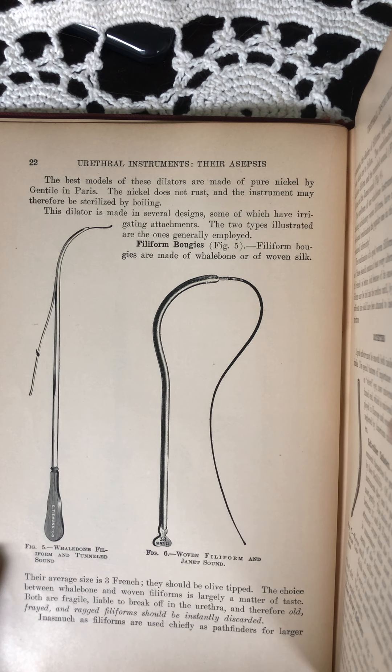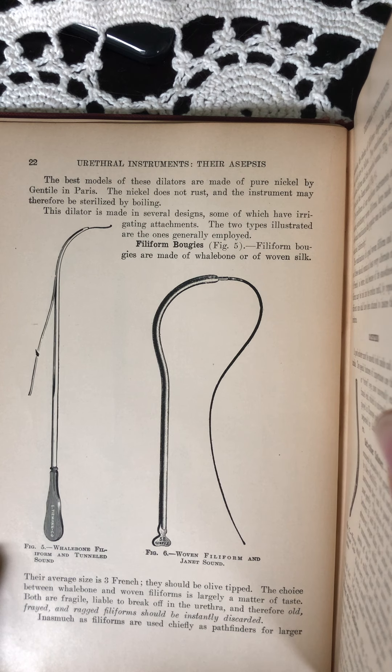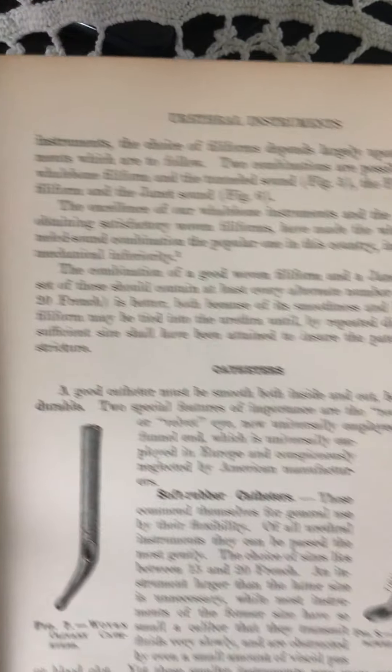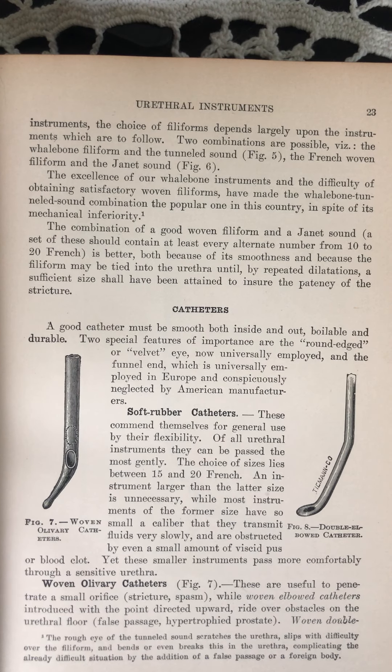The choice between whalebone and woven filiform is largely a matter of taste. Both are fragile, liable to break off in the urethra, and therefore old, frayed, and ragged filiforms should be instantly discarded. Inasmuch as filiforms are used chiefly as pathfinders for larger instruments, the choice of filiforms depends largely upon the instruments which are to follow.